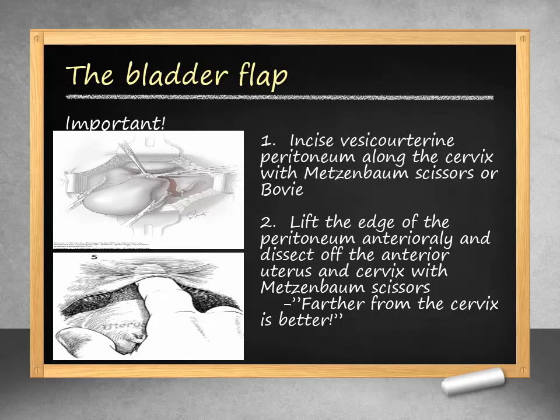Now that we have freed the adnexa, we will focus on creating our bladder flap. The vesicouterine peritoneum is first incised along the cervix with Metzenbaum scissors. Next, the peritoneum is lifted anteriorly and the bladder is further dissected off the anterior cervix with blunt or sharp dissection. Remember, grasp farther from the cervix — farther from the cervix is better.